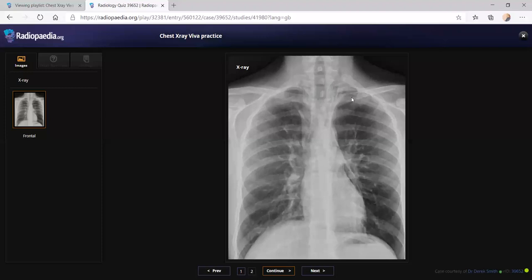There is no trauma, right? Yeah, it's actually a spontaneous pneumomediastinum in a 20-year-old male. It can come with any aggravations like vigorous exercise, Valsalva maneuver, or it can be a difficult labor or any continuous cough. So these are the precipitating factors for spontaneous pneumomediastinum. The complications are pneumothorax, and it can cause a tension pneumothorax. It can lead to secondary infection and all. So you have to inform the referring clinician. This patient must be admitted and observed, given conservative management to see whether it is progressing or not. So it's just because of vigorous exercise?